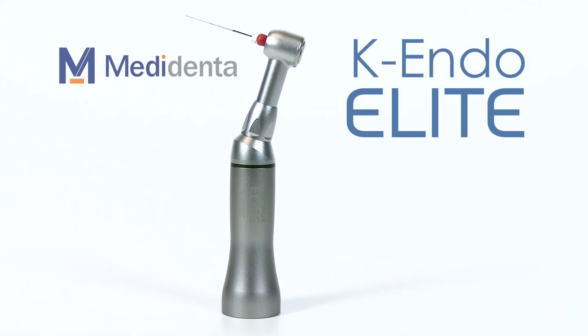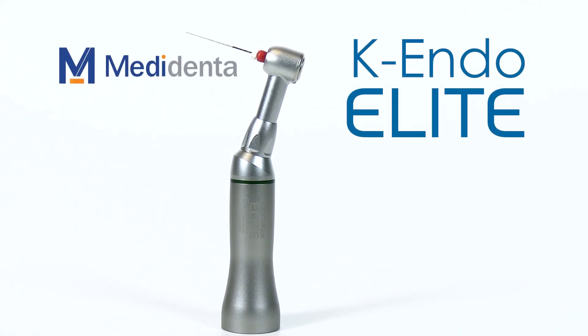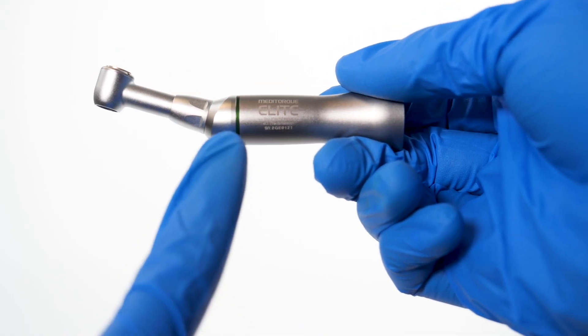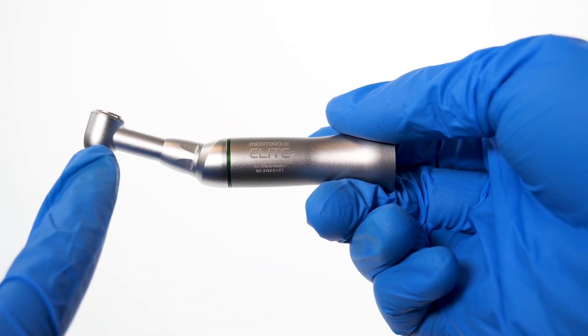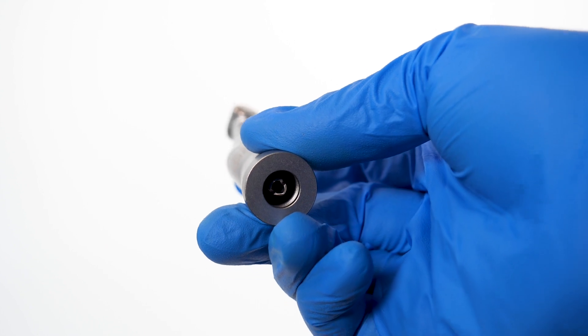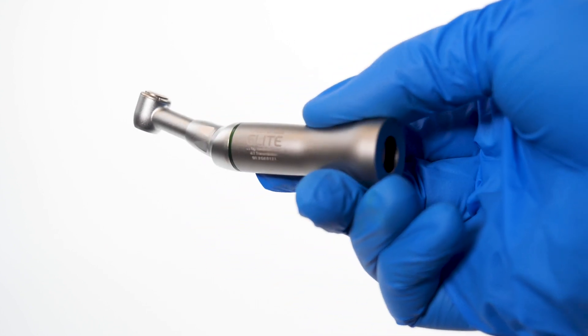The K-Endo Elite is an essential endo attachment for root canal therapy. It features a smooth stainless steel titanium finish and an E-type configuration for use with any E-type restorative motor.